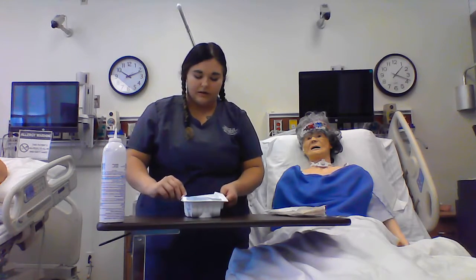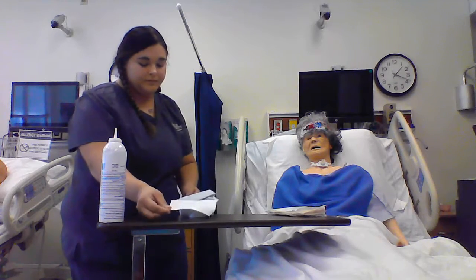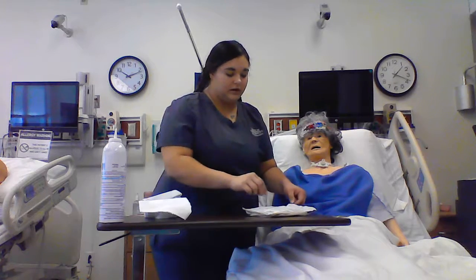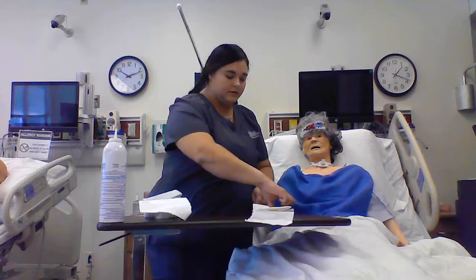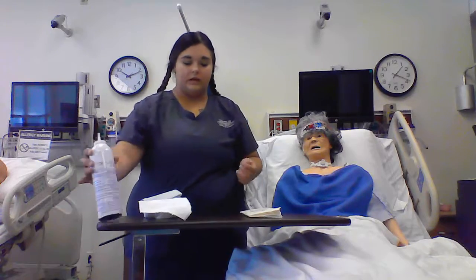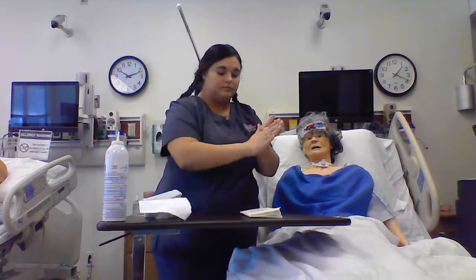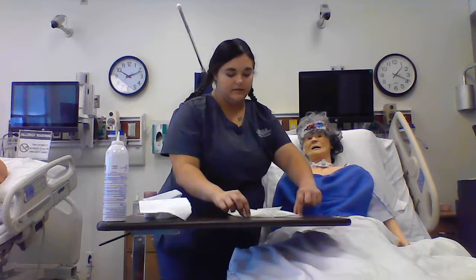I'm going to open up my trach care kit here. And then I'm going to don some new sterile gloves. Open up my sterile gloves. I can throw that out. And then if I need to, perform hand hygiene once more. Then now I'm ready to open up my sterile gloves.